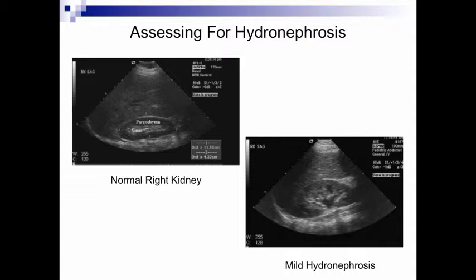When you image the normal kidney, you'll see, as we talked about in the FAST exam, the typical echotexture of the liver, a very clean, bright line between the liver and the kidney, which is the hepatorenal space, without any anechoic fluid in it. You'll see fascial delineation of the kidney as a bright line here, and then normal renal cortex has this type of echotexture, and then the renal pelvis and renal calyces have bright hyperechoic echotexture.